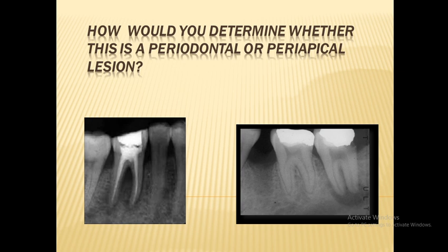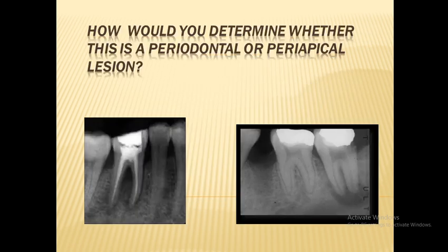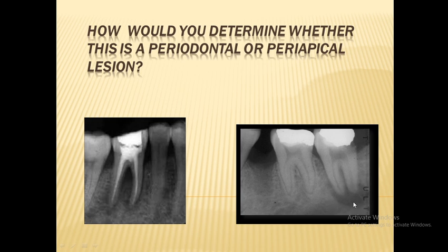In case of a primary periodontal lesion, this is a periodontal abscess. Look at this radiograph — this is a periodontal lesion. Can you see the radiolucency around the roots? That indicates periodontal disease. This is a periodontal lesion and this is a periapical lesion. Can you see the radiolucency is at the apex? We call that a periapical lesion.